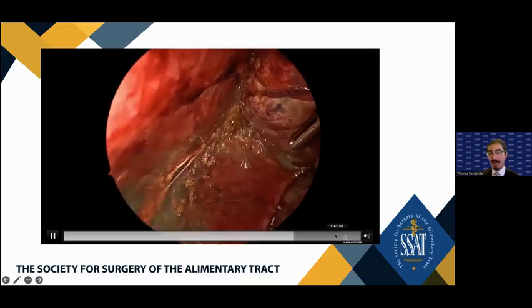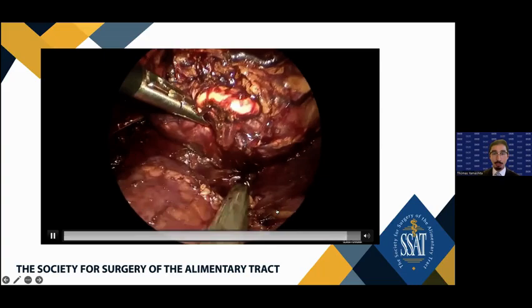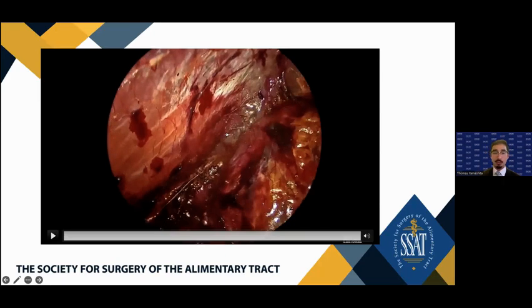I'm going to expedite a little bit because of time. Here's just me taking the other retroperitoneal approaches inferiorly. So we have most of the adrenal gland already freed up, a little bit on the medial portion here, a little bit of attachment to the paraspinous.